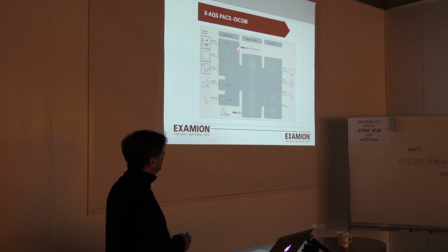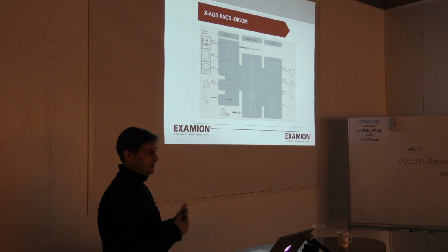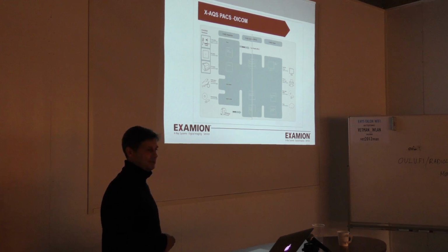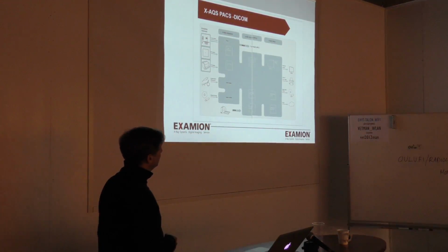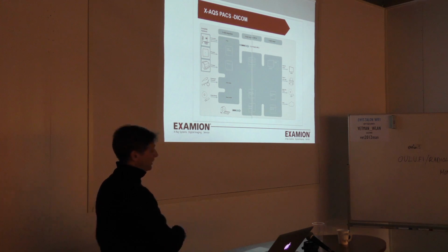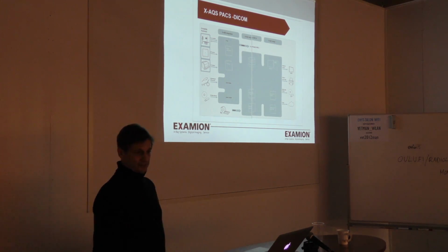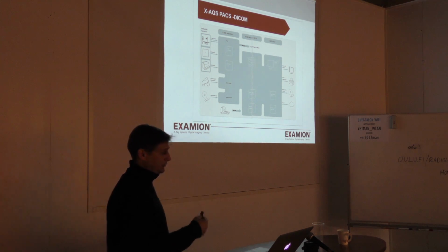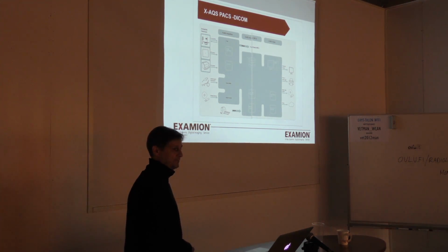And this is done by DICOM protocol, which means some protocols need to be connected so they can speak the same language. It's very important to know that just because you have the label DICOM, it does not mean they will be able to do that. DICOM doesn't mean anything unless you actually find out what it means for that one single part within the system. Every part within the system, whether it's hardware, software, a certain function, a certain procedure that is built in, all these need to have a separate DICOM statement.